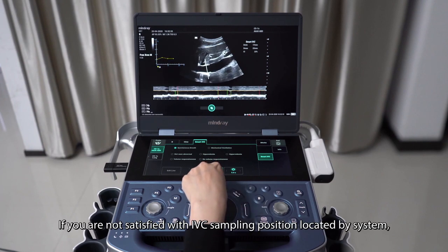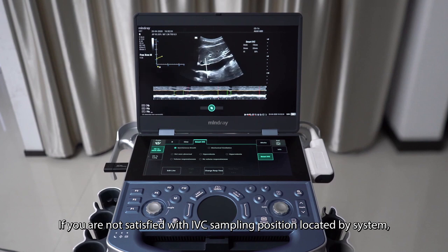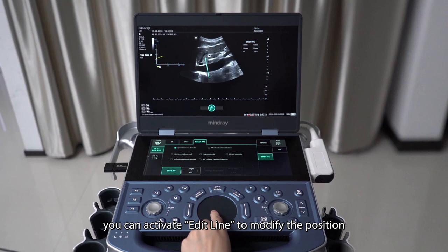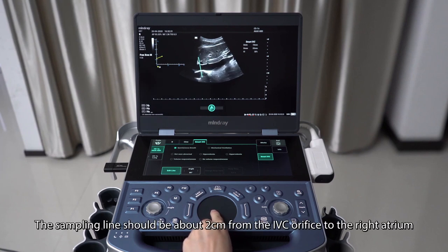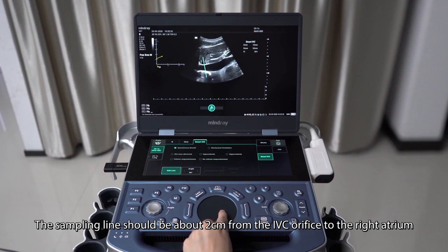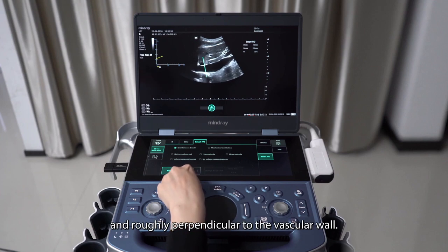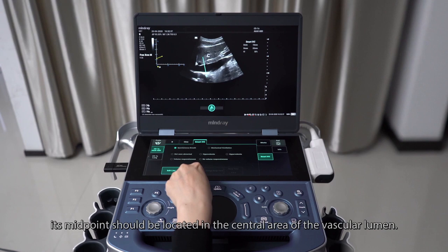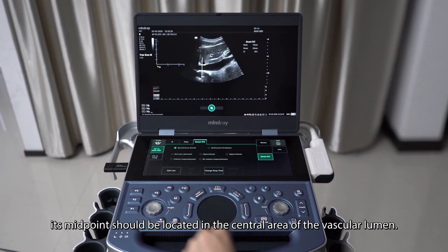If you are not satisfied with the IVC sampling position located by the system, you can activate Edit Line to modify the position and angle of the sampling line. The sampling line should be about 2 cm from the IVC orifice to the right atrium and roughly perpendicular to the vascular wall. In addition, its midpoint should be located in the central area of the vascular lumen.